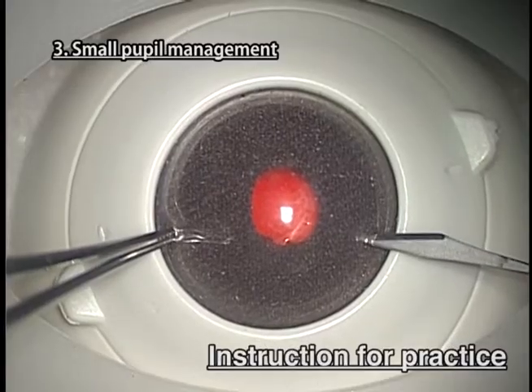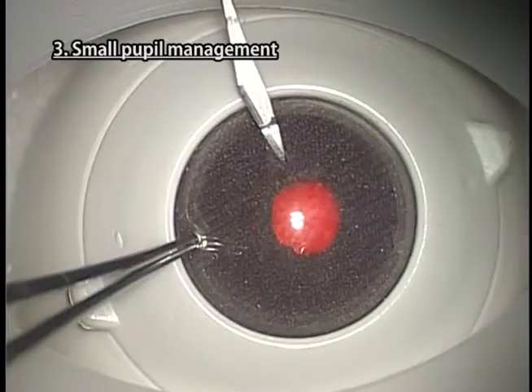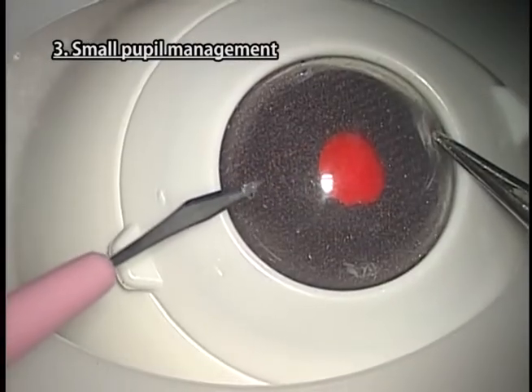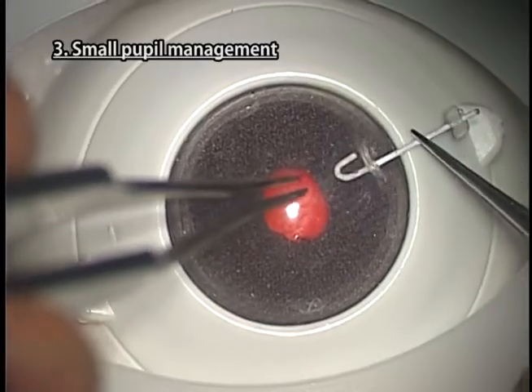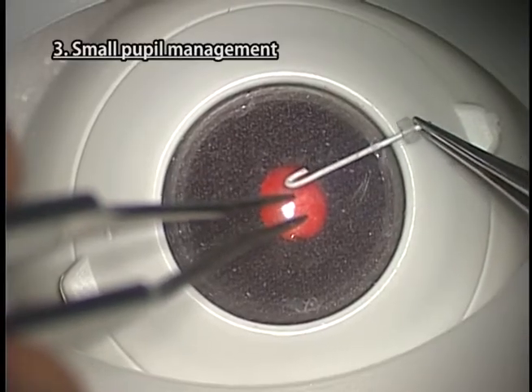Instructions for practice. Make four side ports with a knife and insert mock iris retractors or true iris retractors. Kitaro's cornea is a little harder than human eyes, so it is necessary to make slightly larger side ports than for human eyes.